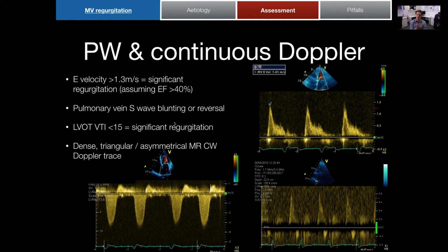So the first one, let's talk about color and the continuous wave Doppler. I use my color Doppler to try and guide. I'm sorry if it's a little small, but you get the idea. For mitral regurgitation in this view, I'd use the color Doppler to tell me where the jet is going, and then I'll try and get myself in line with my continuous wave Doppler cursor, to make sure I'm parallel with it so that I'm lining up with the mitral regurgitation as best I can.